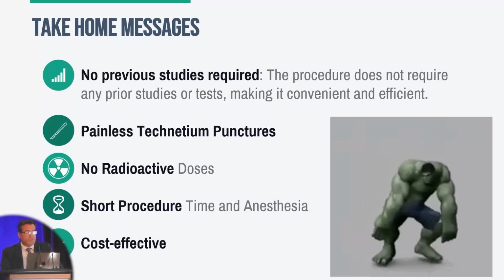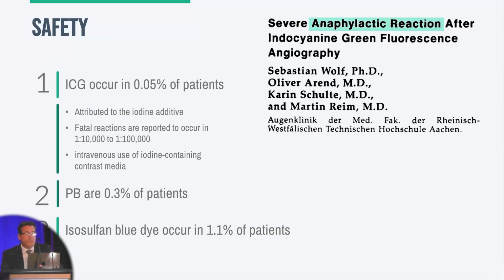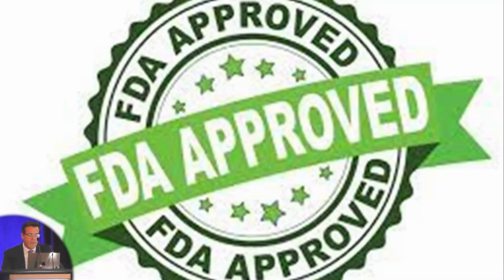So it's important to consider, after everything we see, that we don't need a previous study. It's not painful for the patient. We don't give a radioactive dose. It's a short procedure, and of course, it's cost effective. And when we talk about safety, it has less toxicity than the other procedures. Finally, it's been approved by the FDA.